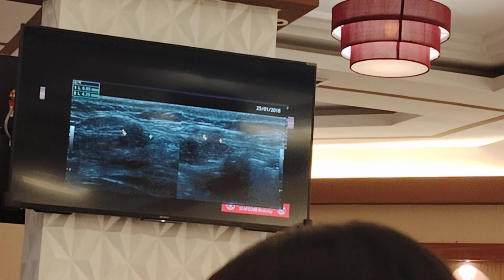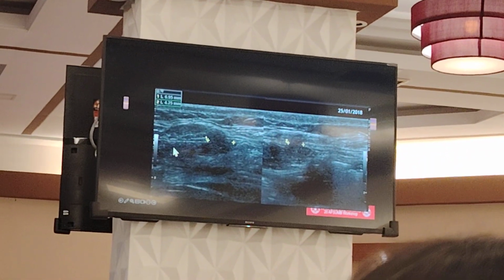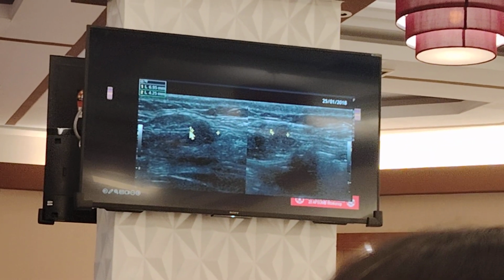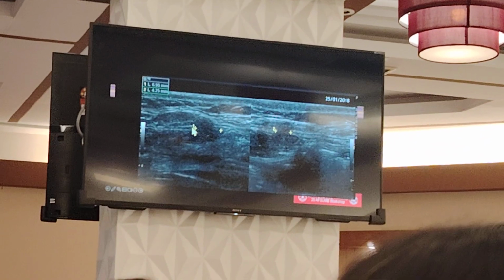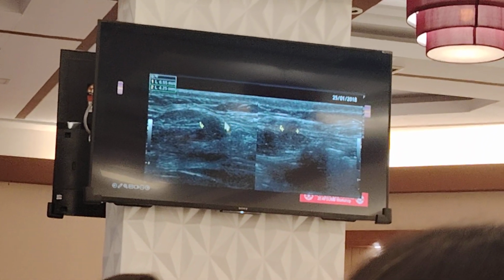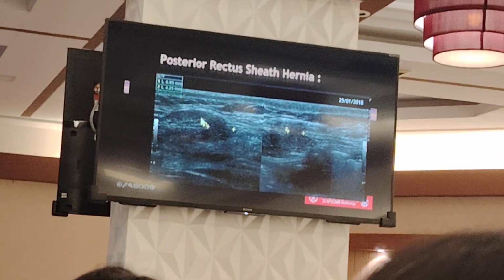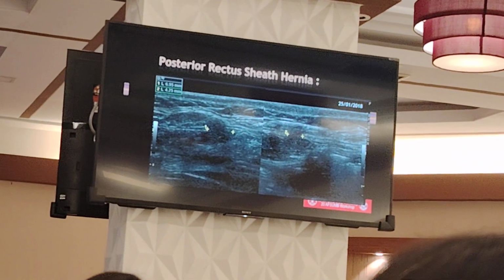Now about this case, this is an absolutely uncommon or rare case. This is rectus abdominis, this is anterior rectus, this is posterior rectus, and the patient, a male patient, was insisting that there is a lump which he was feeling, mild tenderness was there. This was the defect in the posterior rectus only, but not in the anterior rectus. We appreciate this. And extraperitoneal fat, this kind of hypoechoic fat, was protruding into the rectus abdominis muscle. This was a posterior rectus hernia. But I was unaware of that at that time when I examined the case.